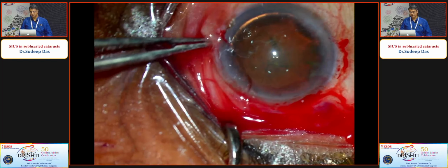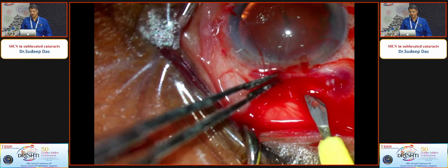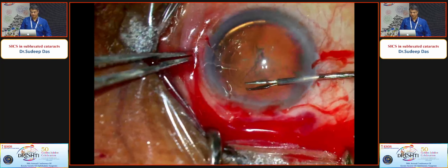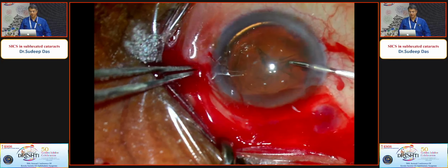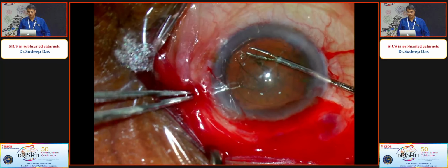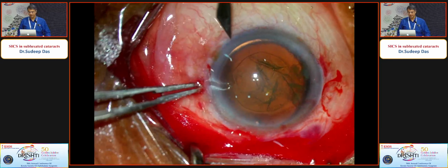So these are, I'm making these very scleral openings. This I learned from Dr. Chi Sun Fake from SNEC. So when I need, I will use these hooks, but I don't want to lift up the bag and the anterior capsule, so I want them to be more scleral, very close to the capsular bag.